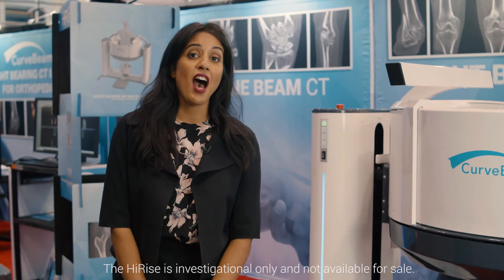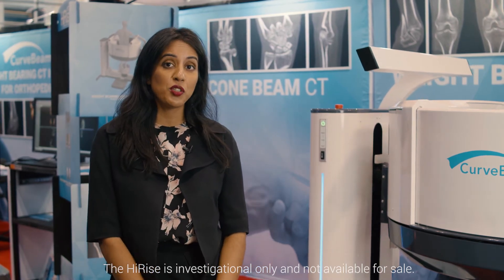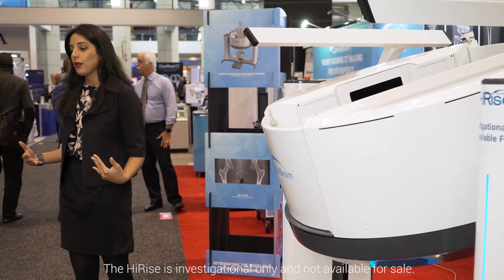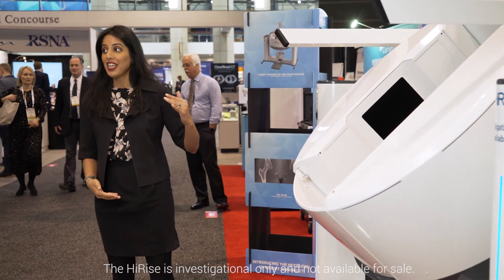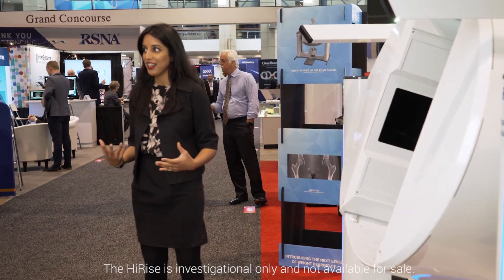The high-rise is designed to be a true multi-extremity solution. Not only can the gantry raise around the lower extremities for standing scans, but the gantry also flips 90 degrees to accommodate upper extremity scans as well.